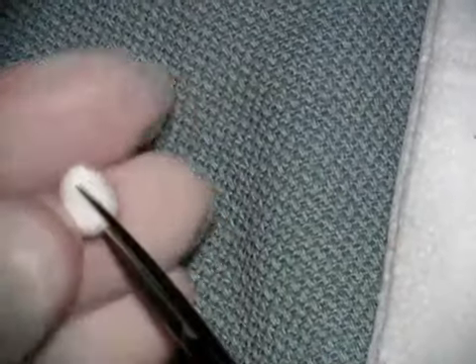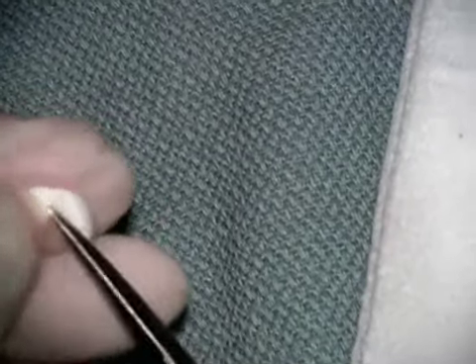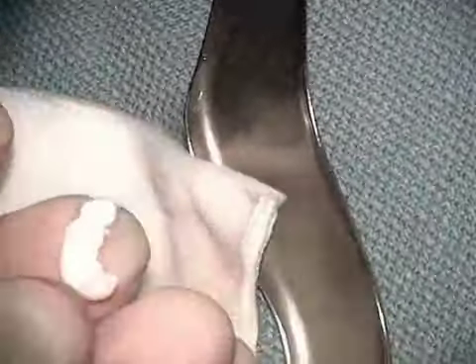So I'm going to take that little piece here and cut it in half, and then I'm going to score it up the middle in a couple places, sort of a triangular scoring or Y-shaped scoring, so that I can use this and pack it over the bone, actually use that to hold the Grafton gel in place when I put the crown on. So this is going to act as sort of a barrier membrane.